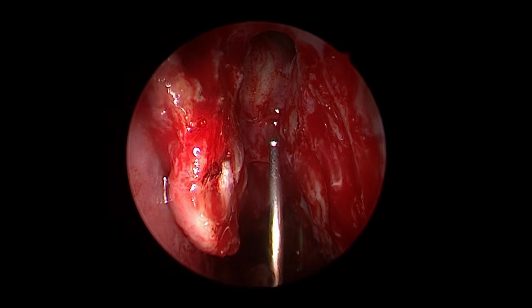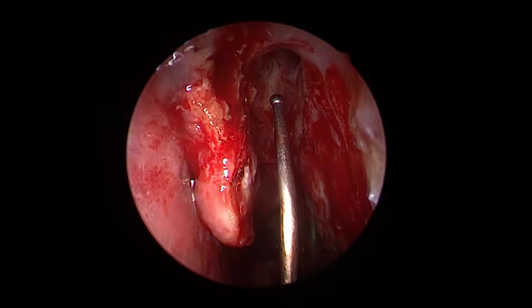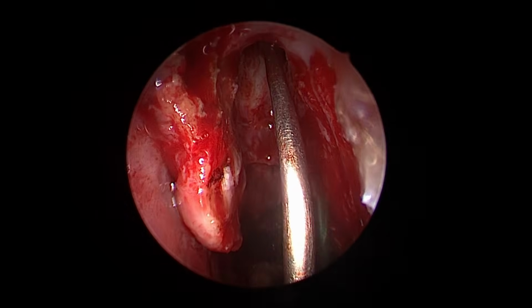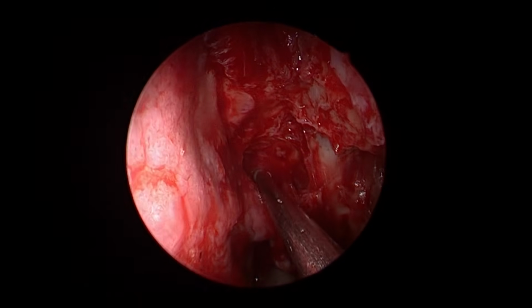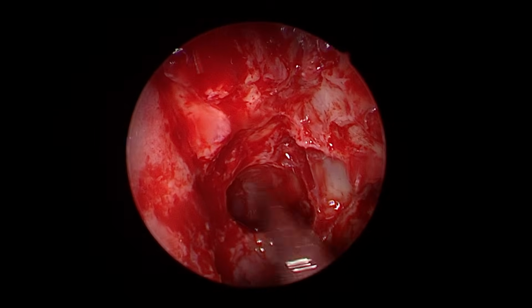From beak to this is more than 2 centimeters. Always more than 2 centimeters. So while working for the frontal sinus towards the beak, you are already centimeters away. So don't get frightened all the time with the vessel. We didn't bother to even mention it.